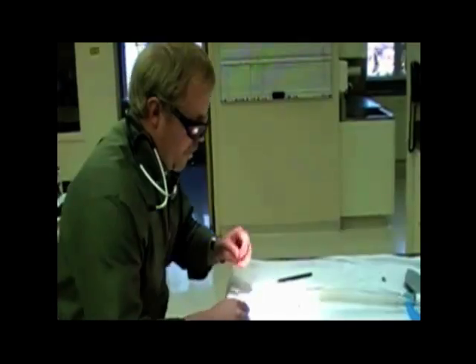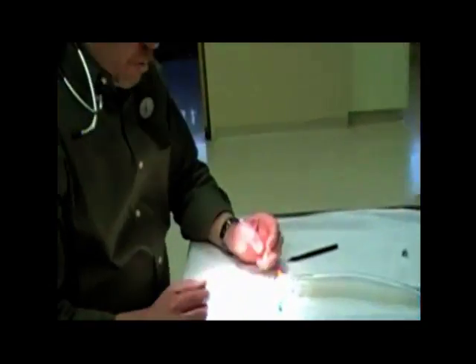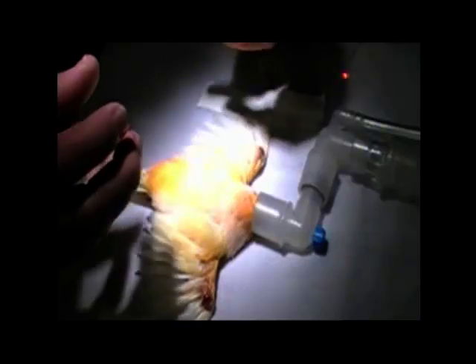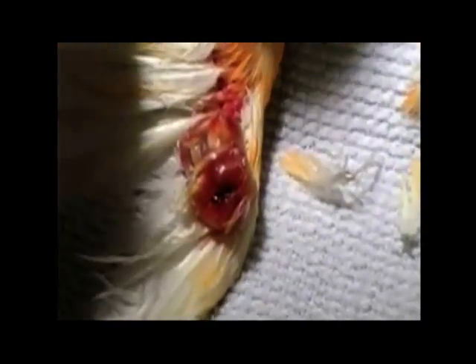I've got a canary with some feather cysts on both wings. These are large items that occur genetically in these canaries. They'll have a feather follicle that isn't exiting its proper exit, and here's that aberrant or abnormal feather.